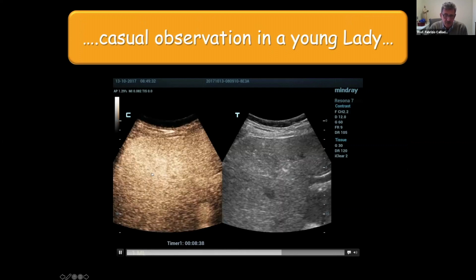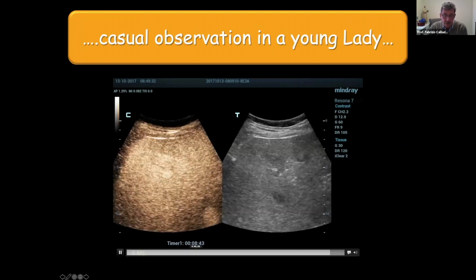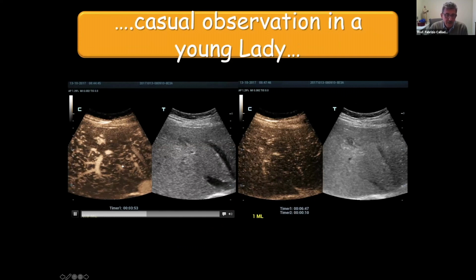It's not more recognizable after 8 minutes. But look how this liver is full of contrast after more than 8 minutes from the beginning. This, I think, is a very good thing from my mind, right? Okay, we started with some sort of MIP, maximum intensity projection, and look what is happening.